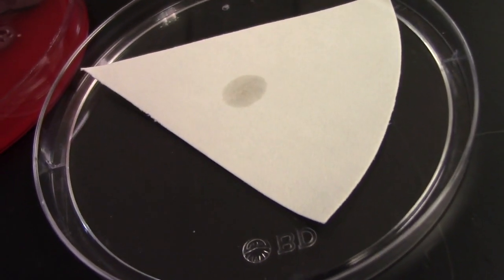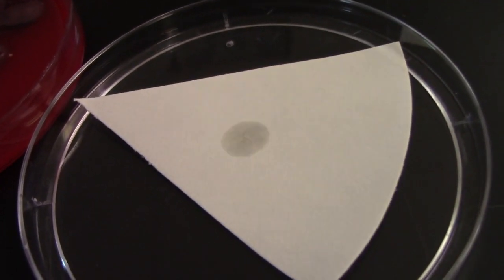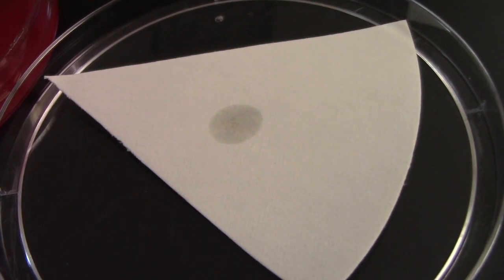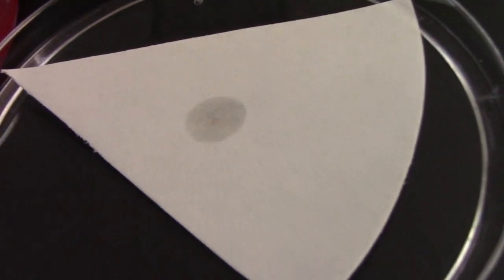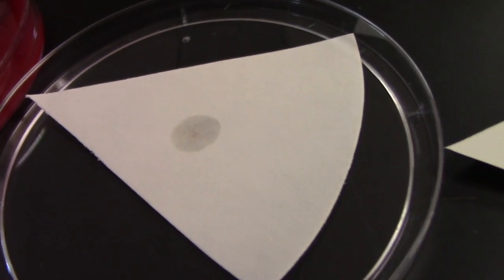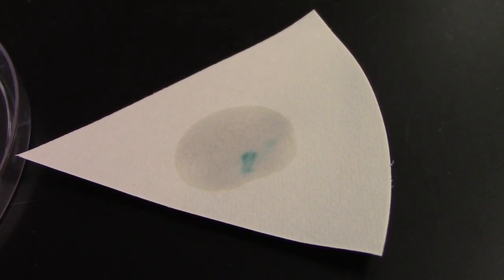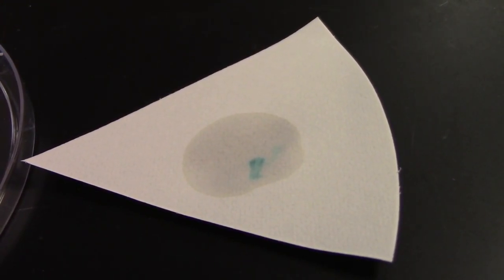The indole test tests whether the bacteria produces an enzyme that's able to split indole from tryptophan. This one shows no color change, so it's indole negative. You might see a slight pinkish color on a negative test, but you will not see that distinctive blue-green color that you see on the positive test.